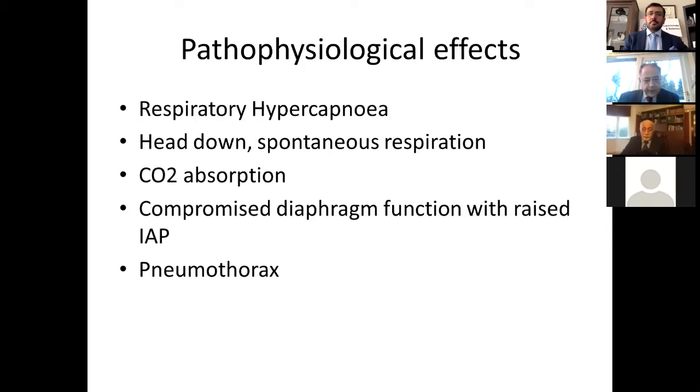Right. So CO2 is pushed under pressure into the peritoneal cavity. Liters and liters, especially in long procedures. And anesthetic and ventilation technique can help most of the time to remove the hypercarbia, because if you leave it for long, it can actually cause some acidosis and metabolic problems.